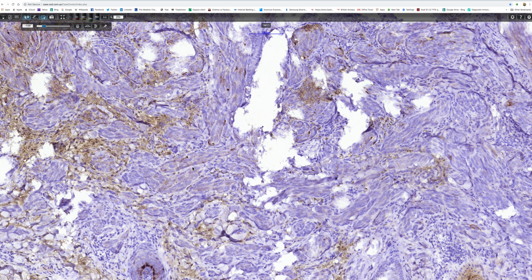Features that you should look for in a Spitz nevus that we haven't discussed really are cytological. One needs to look for evidence of something else going on. For example, one might find some expansile nodules in the dermal component. That would be worrying. One might find marked nuclear pleomorphism. That would be worrying. Spitz nevi, particularly epithelioid Spitz nevi, are pleomorphic by definition, but the pleomorphism is a sort of uniform pleomorphism. All the cells look similar, whereas in a malignant process, the pleomorphism would vary very much from one cell to another, so they'd all look different.